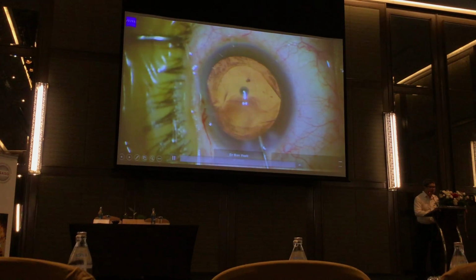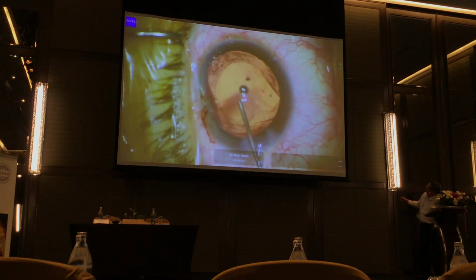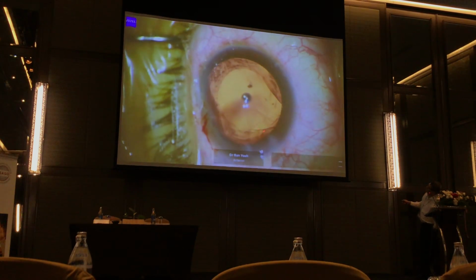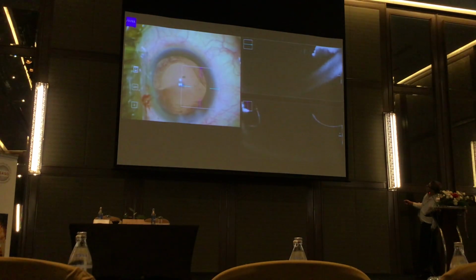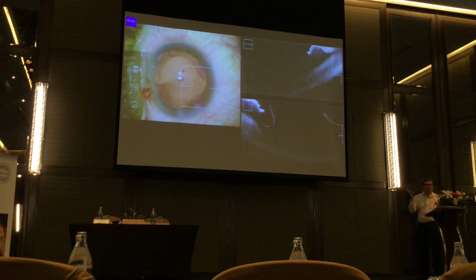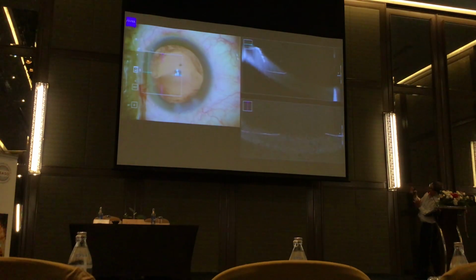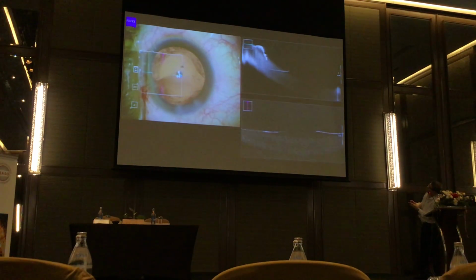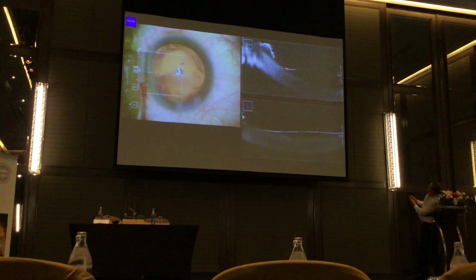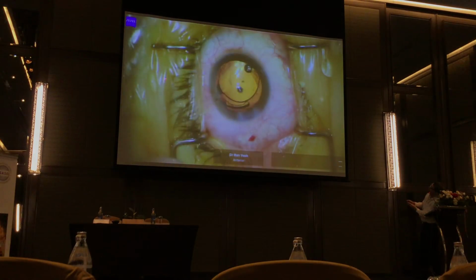What about this one? You can see this one has a big radial tear here which looks very scary, right? That's the edge, there's another edge, and again on the OCT I'm showing you that's the edge of this too, nicely everted. If you believe Dr. Prakash's sign, when the flaps are standing up and they flap as you're doing the IA, you usually don't have a posterior extension. If the anterior capsular rim is not torn, it's flat, like this, like this, like this, because we're scanning over there.